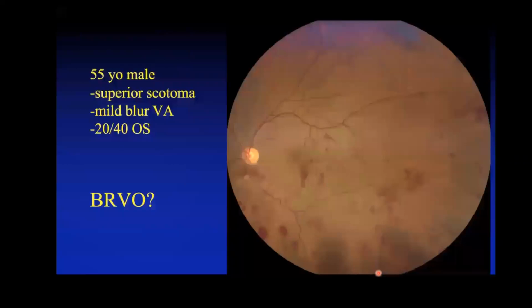Here's another case that I wanted to show you. And this case was interesting because it stumped some of our fellows. This was a patient who was referred for a superior scotoma and blurred vision. The acuity measured 20/40 in the left eye, and the patient was initially diagnosed with having a branch retinal vein occlusion. And if we look at this color fundus photo, and this is the Clarus instrument that did this fundus photo, we can see that there are some features that we would see in branch retinal vein occlusion.